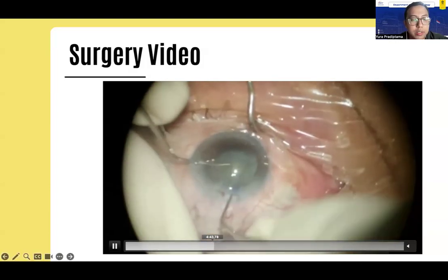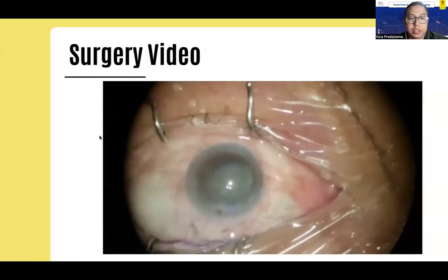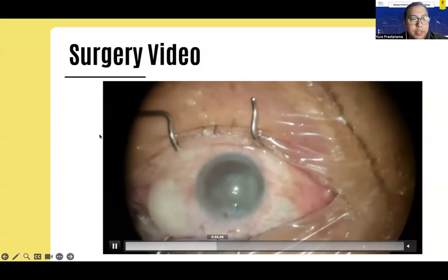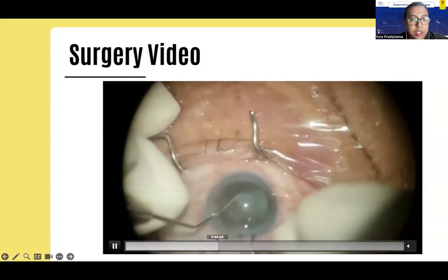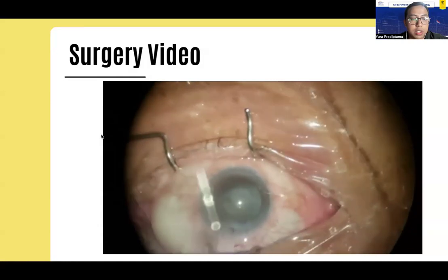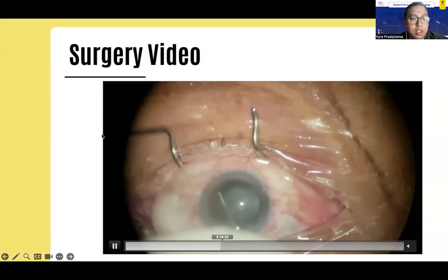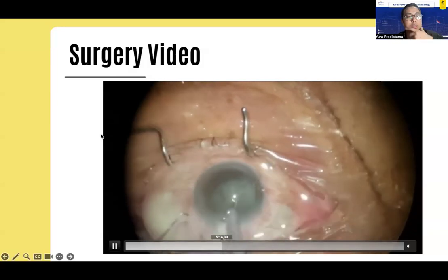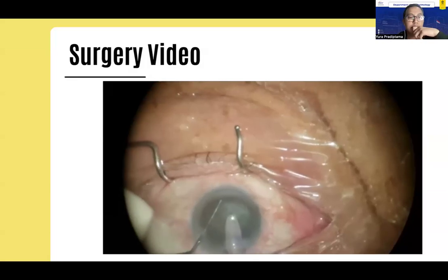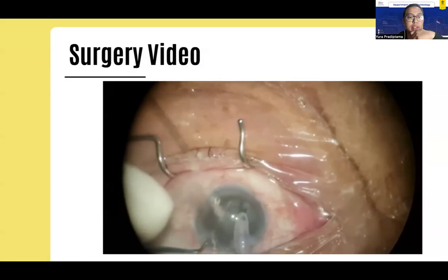It was quite hard because of the movements and the instability of the capsular bag itself. We used a Tuschinski to try to rotate carefully to release the lens. And in these sequences, we tried to do the phaco using the phaco chop technique to minimize any lens rotation movements during the procedure.